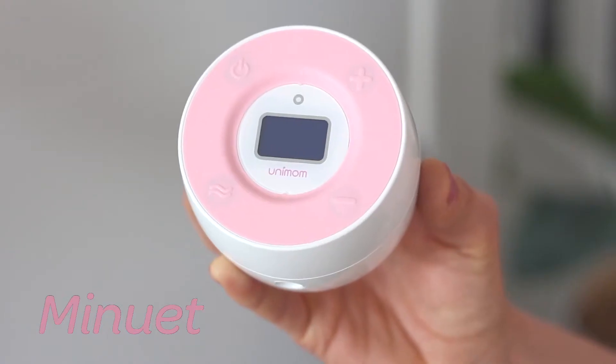Unimom offers a large, affordable range of breast pumps and breastfeeding products, and I am really excited to show you the ultra-efficient breastfeeding aid, the Unimom Minuet LCD.